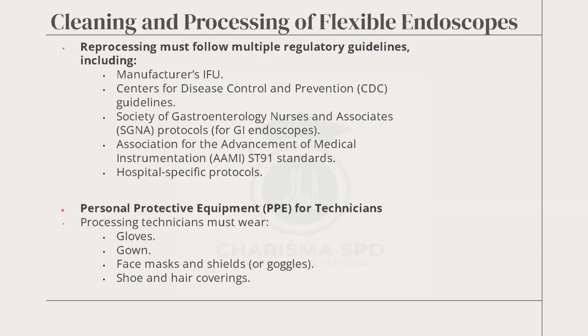So personal protective equipment: you need to wear this personal protective equipment to be able to handle these scopes with what? Care. Because they come dirty, either through the throat or through your behind. So you need to protect yourself and your family.